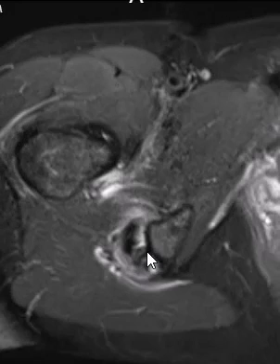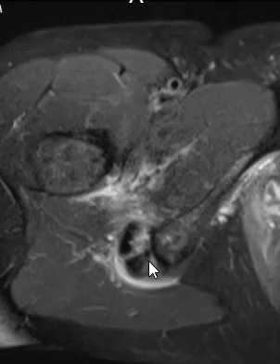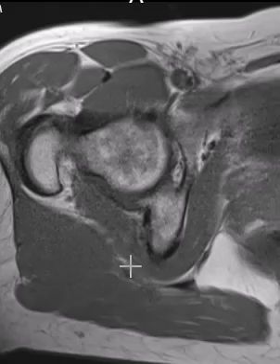We're going to try to see which of these tendons is involved. The more lateral one here is the biceps, so we'll see the biceps more laterally. Going more medial, I'll put up a T1 sequence to appreciate this a little better.